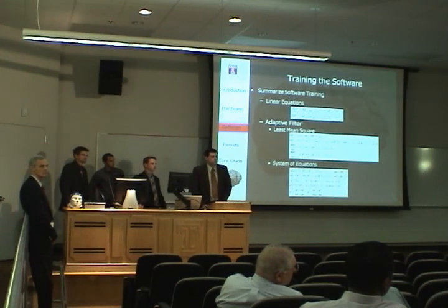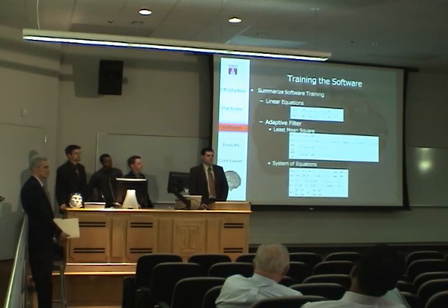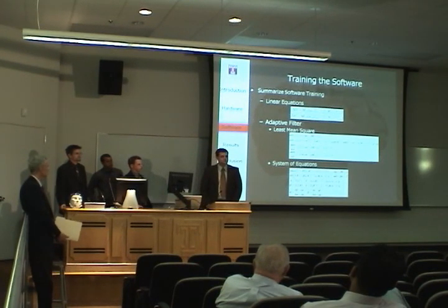Since it's on the head and connected to the scalp, do you find that the hair messed with any of the results, like the length of the hair? There were a couple of questions about that, but we couldn't actually prove that hair length affected the results, especially with the paste and gel we're using in the prep.